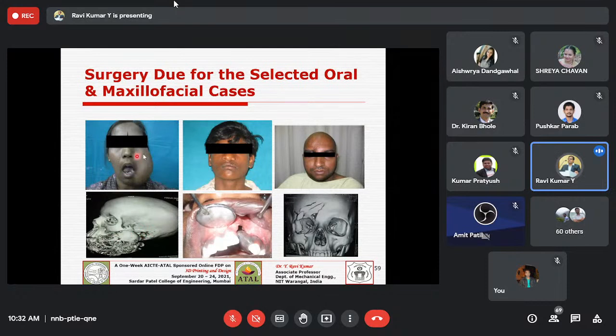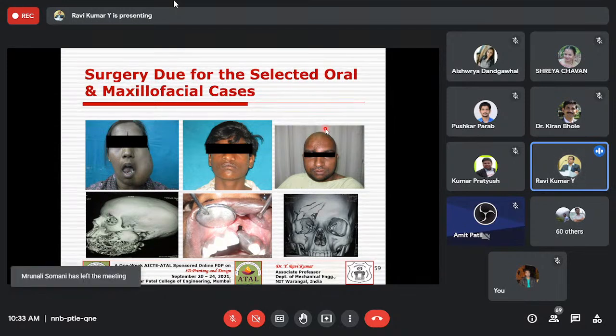cases. Sometimes abnormal growth of tumors happens, or some cleft cases by birth, or head injuries may happen, and then you see the possibility of integrating 3D printing technology. Some emergency cases, some head injury, major loss of blood, and you may be asked to give a model within 1 hour or less. But I'm talking about emergency cases, and that may not be feasible. It may take a minimum of 1 day to print this skull and do further post processing, so processing the data, printing it and using it in the operation theater intraoperatively may not happen within 1 hour. Not all cases are possible, especially the emergency cases.